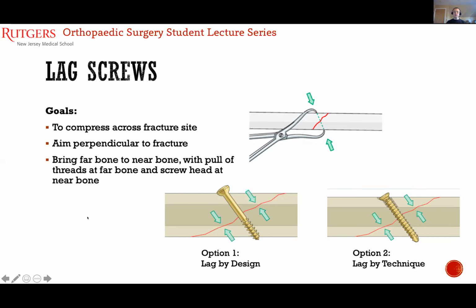I guess I do. You can see how the smooth shank of a designed screw that is only partially threaded, by necessity, by the way the engineers designed it, the near cortex won't have any fixation. It'll just be smooth gliding. But the only way we have to create that when you're using a fully threaded screw is to overbore it. So like Jeremy said, the threads just can't grab it because the hole's too big on that near cortex.